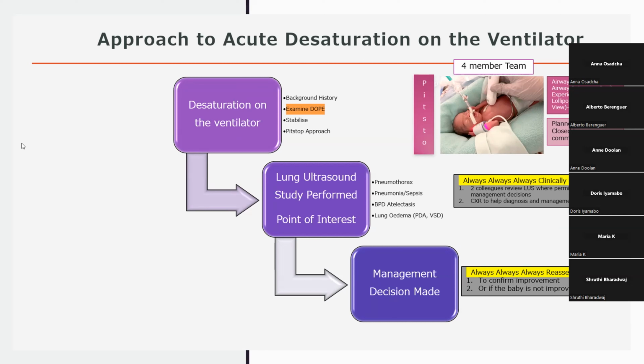It is really risky in this situation if you decide to do one intervention at a time because it'll just prolong, I would say, therapeutic management. How you organize yourself in this situation is also very important. How you keep your machine. Machines are really bulky, and trying to keep a machine on the left or right side of the baby can make a big difference to how you're going to do imaging.